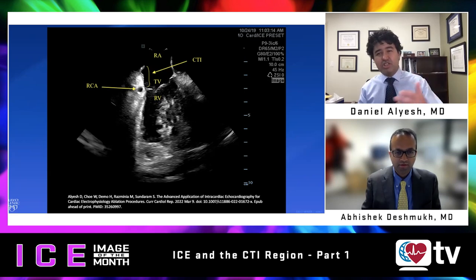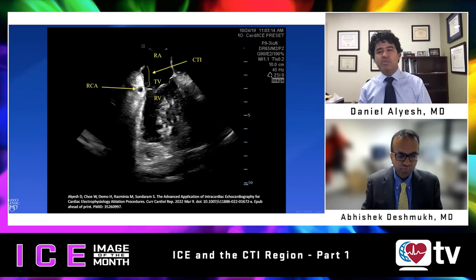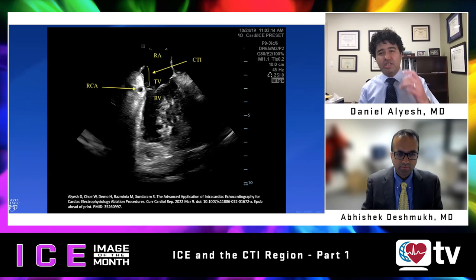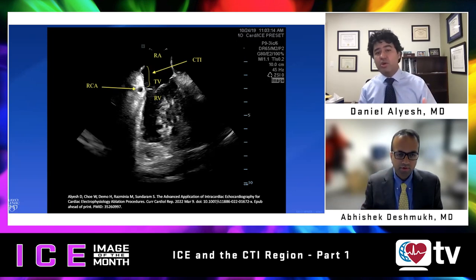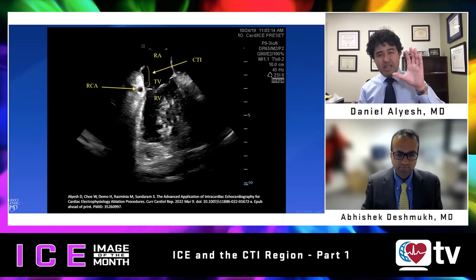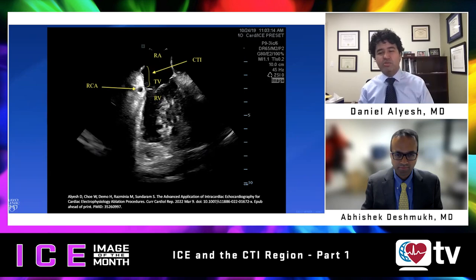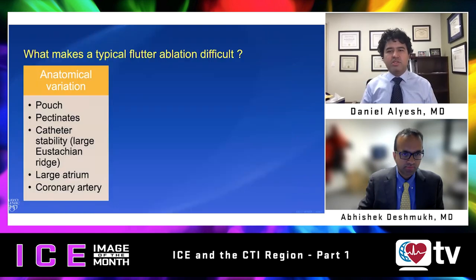We're going to start off with an image that actually came from a paper we recently published where we annotate the CTI. You can see the CTI region, the inflow/outflow view of the ICE, as well as the right coronary artery and Eustachian ridge. We're going to dive deeper into all this, but this is our home base for how we think about ICE imaging as applied to ablation in this region.